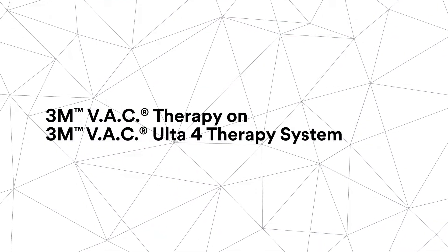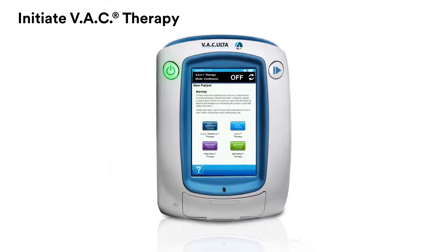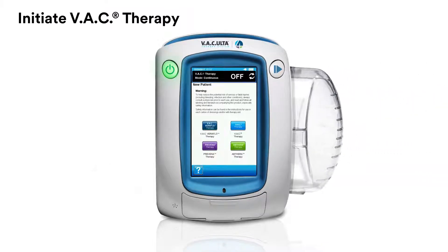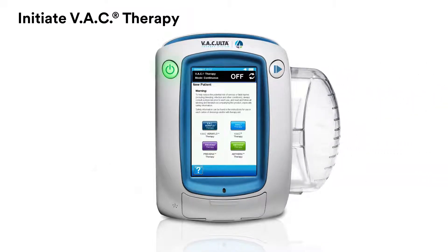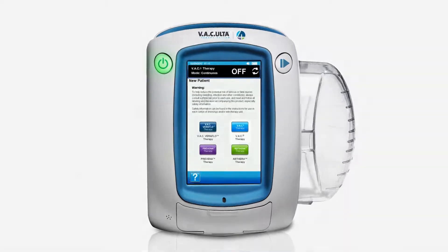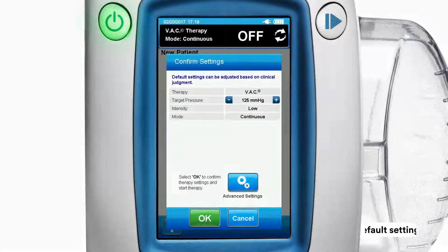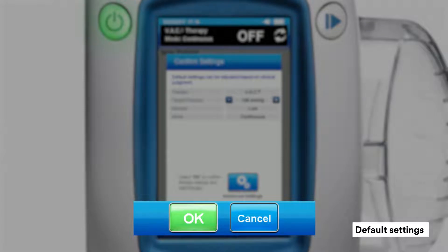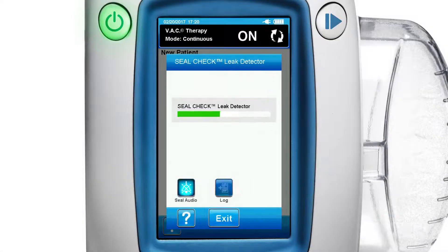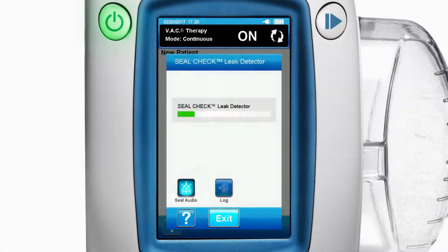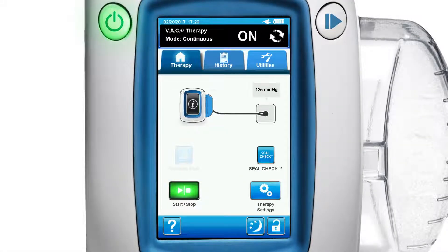To initiate VAC therapy, attach the 500 milliliter or 1000 milliliter canister to the VAC Alta4 therapy unit. Press the light blue VAC therapy button. Next, press the green OK button on the confirmation screen to accept default settings and begin VAC therapy. Press the exit button on the seal check leak detector screen to go to the Active Therapy home screen.